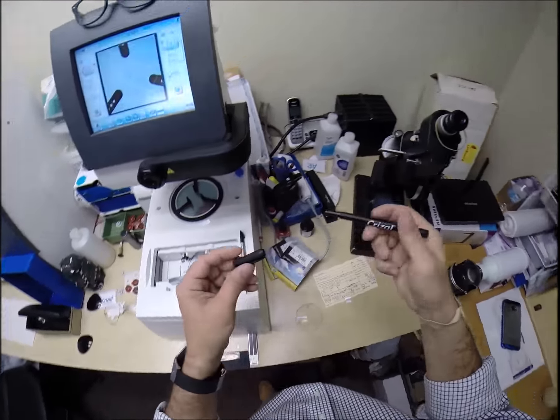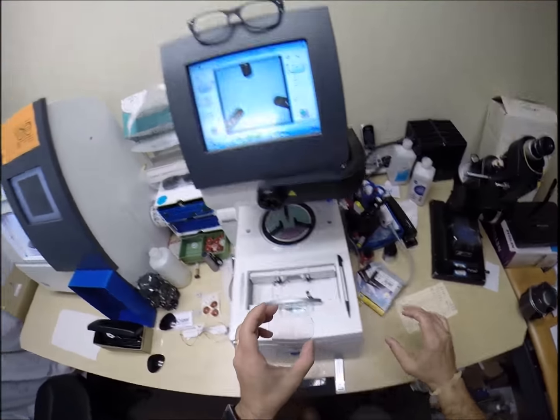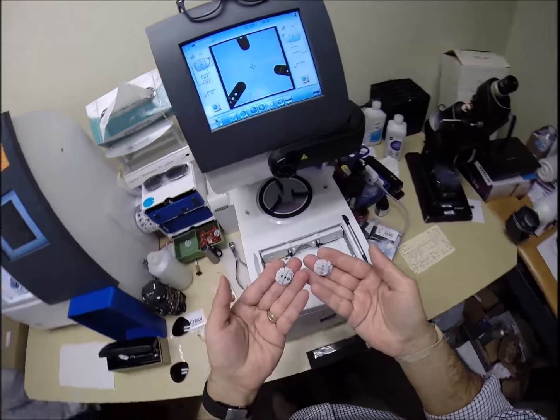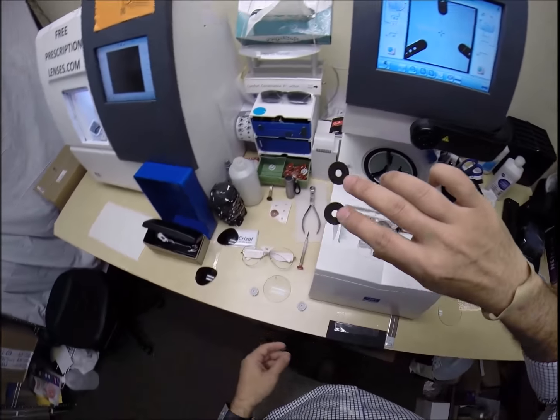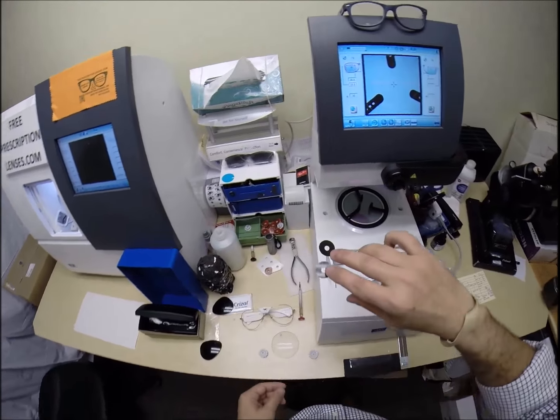If you guys missed any of that, let me recap. Alright, so I need to attach, this is a block, or as I like to call them, Jenny from the block. I need to attach these to your lens while it is cutting, so I need 2 double-sided adhesive stickers, of which the last 2 of my 3. Nah, don't worry, so I can only cut 1 more lens today. Wouldn't that be great? And then I can go home.